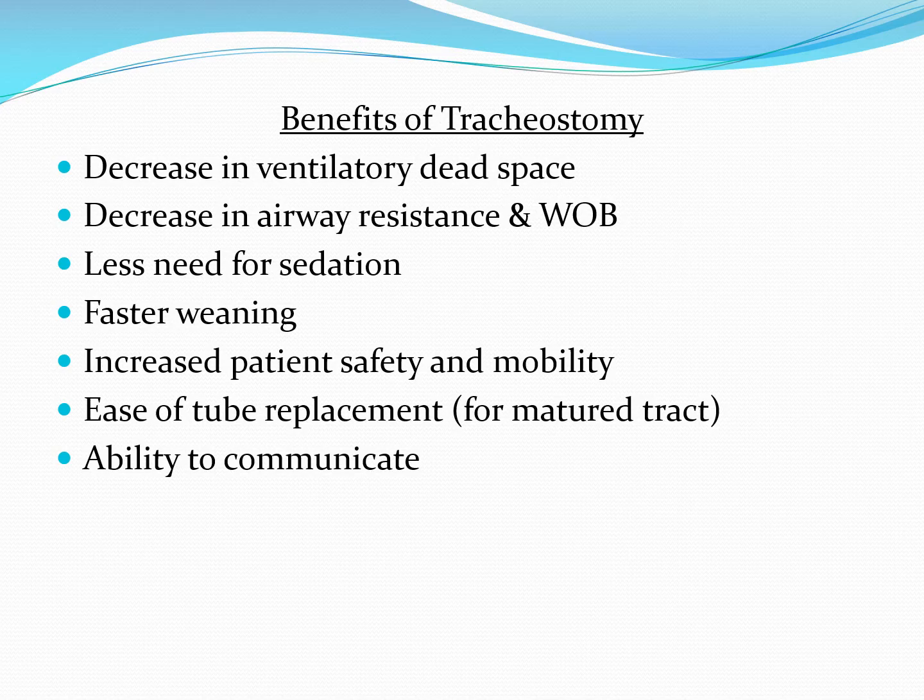Less need for sedation, and the mindset with less need for sedation is the whole fact that they're more comfortable. Once the tube is in place and has been established, that's the hard part. There could be some pain, discomfort associated with that, some bleeding, etc. But once that stoma is established, the trach tube would better facilitate patient being able to eat, mouth care, being able to speak, and just potentially being more comfortable than having an endotracheal tube in their mouth.